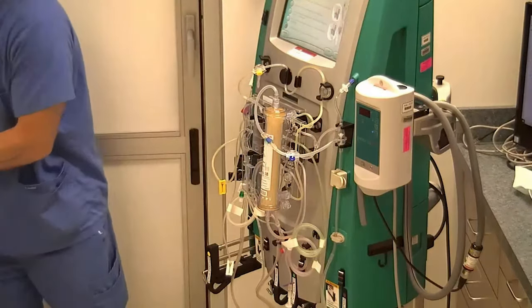You want to make sure when you scrub the hub, after you scrub the patient's catheter, you don't let it go and touch the patient's gown or their skin. You always hold on to that and then connect all your access and return lines. And then from here, once you get everything connected to your patient, you would hit continue. Just want to verify your patient connection. And from here, you would just hit the start button. And now your machine will start to run and start to pull blood from your patient and start to perform dialysis.